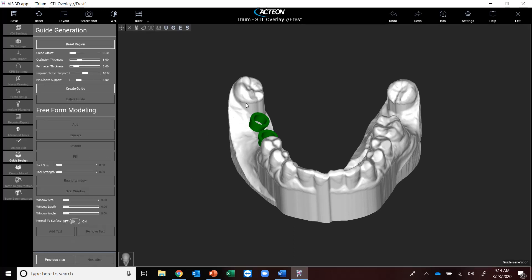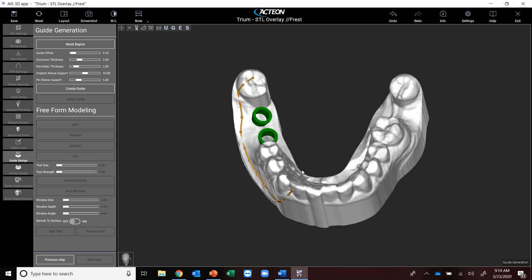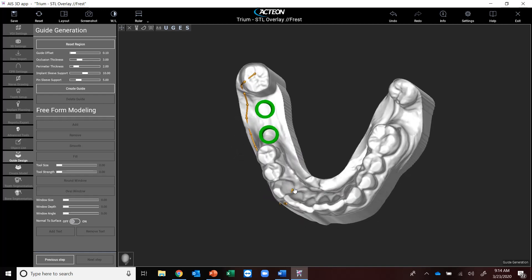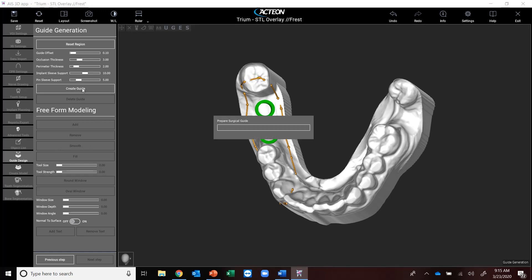I'm going to hit next step, and it's going to pop me into the guide generation. What I'll do is I'm going to start left-clicking like you see on most softwares, just tracing the area in which I want that guide to cover. All I'm doing is left-clicking, and then I'll go to generate guide.